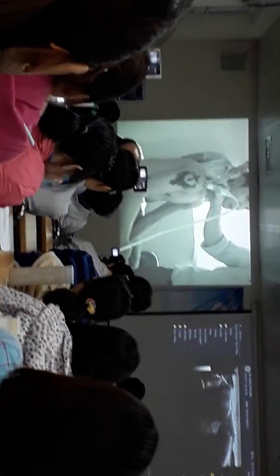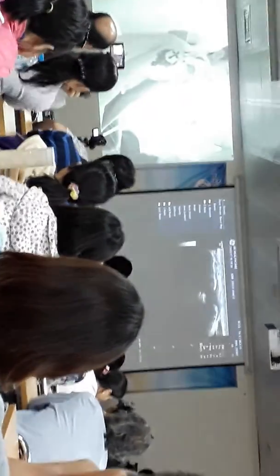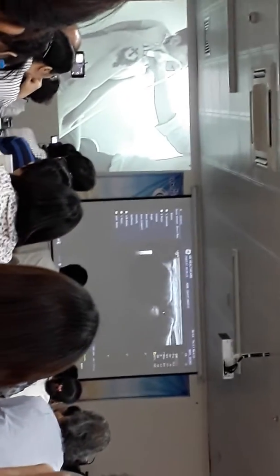So there's two techniques. First of all, just get the patient to hang on underneath the bed, and then you ask them to lean back, and that will pull the arm down. And with that traction, what you want to do is just see if there's any separation of the joint when the patient's pulling their arm down. The AC joint will widen. So you just get them to traction, release.